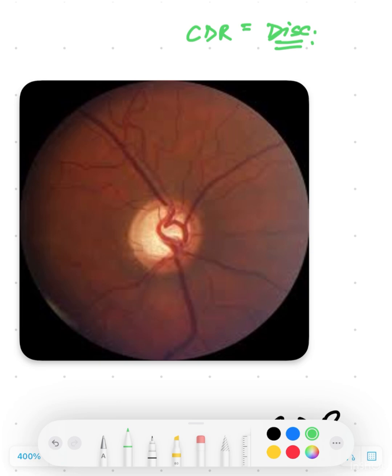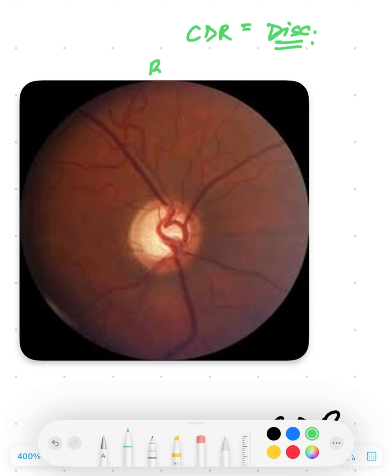Today we are going to keep it very simple — how to analyze a cup-disc ratio. There was one mistake I committed during the first year of my residency: assessing the yellow part of the optic disc as the cup and then figuring out the cup-disc ratio from that. That is wrong. The correct way is to look for the bend in the vessels.